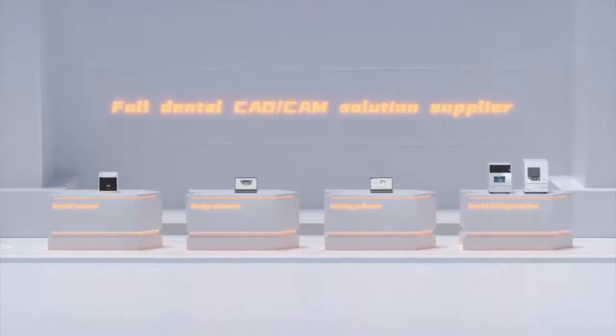Brand new products and innovative technologies challenge traditional methods and create the future of smart dental laboratories.